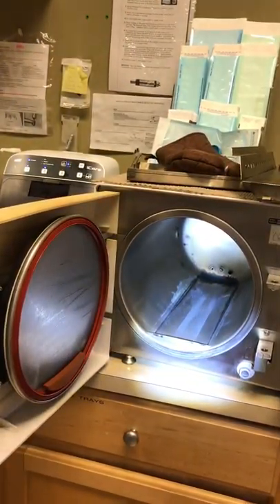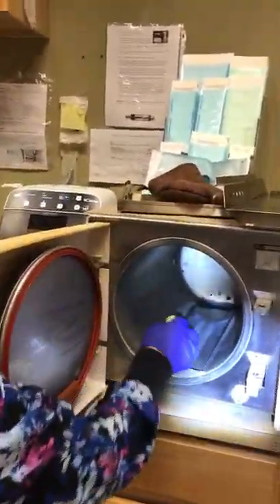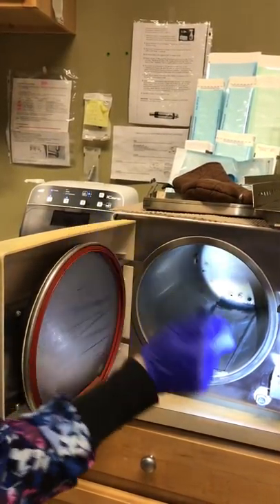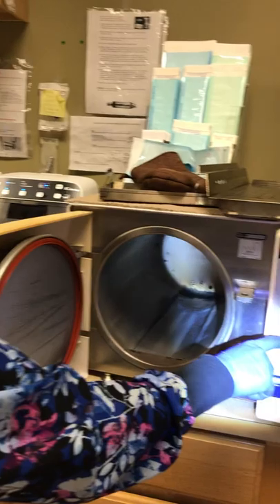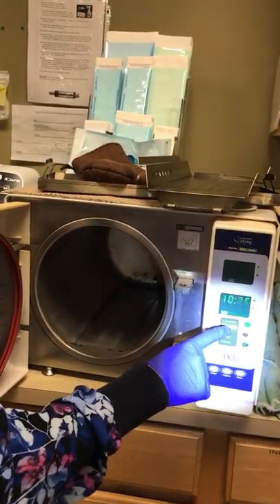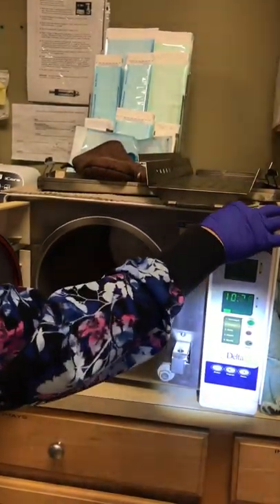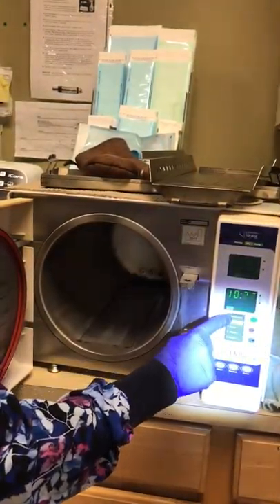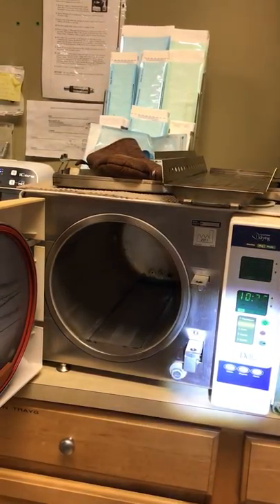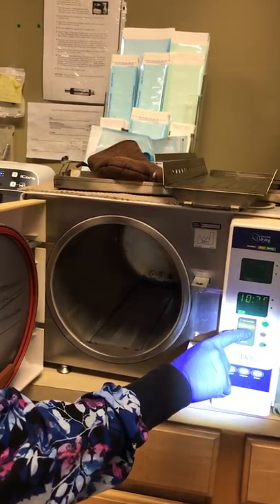Then what I'll do is take a sponge and just wipe it back and forth. Put all your innards back in, run it on a wrapped cycle, let it run its thing, drain out the water, put more water in. You're going to do an unwrapped cycle, let it run its course, drain the water, and set it back to unwrapped.